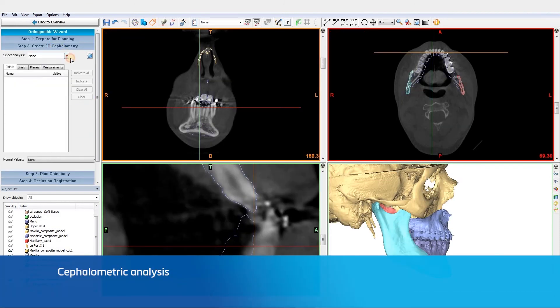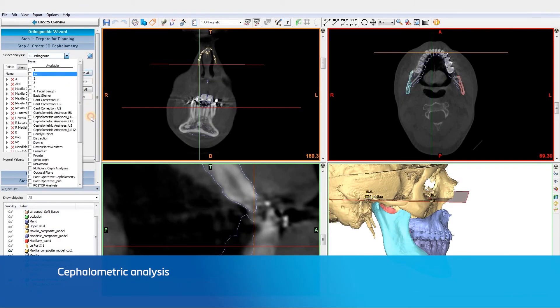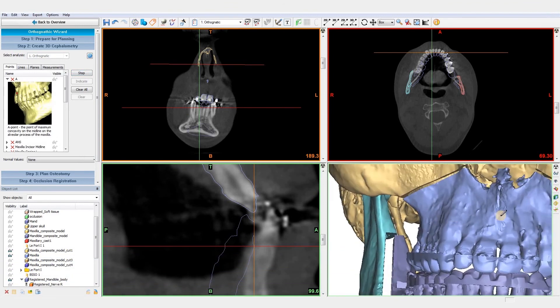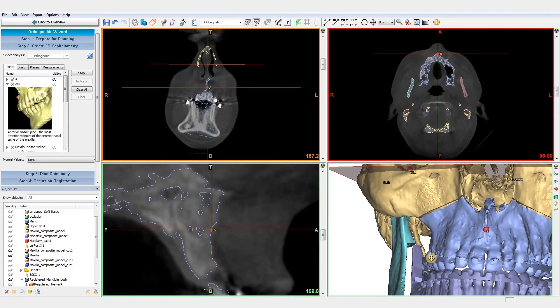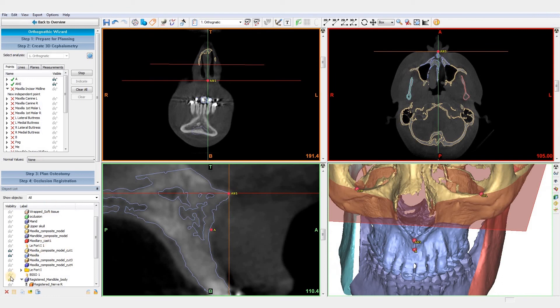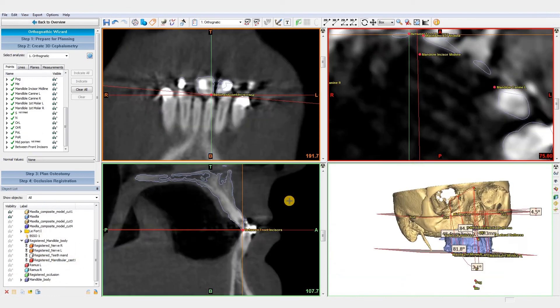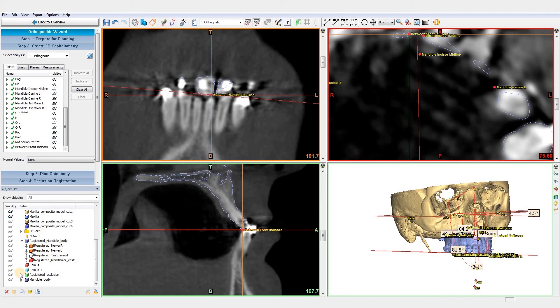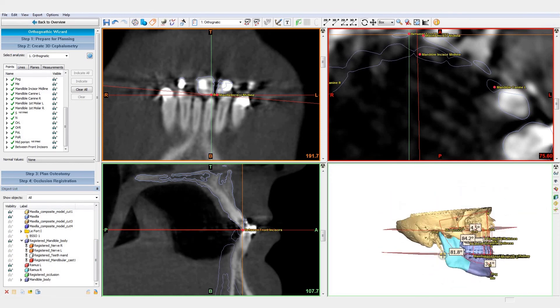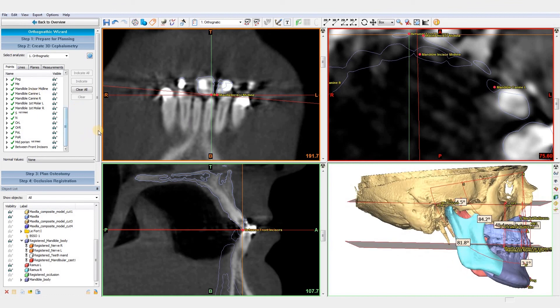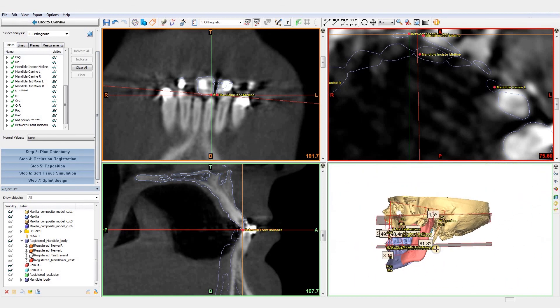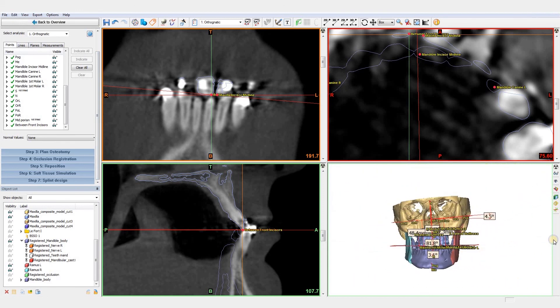The last step before starting the planning is the indication of the cephalometric points. Indicating these points is easily done. After selecting the analysis of your choice, the software guides you to indicate each point. Next to the extensive library of available cephalometric analyses, it is also possible to create your own fully customized analysis. Based on the indicated points, the cephalometric measurements are automatically calculated and updated during the planning process.